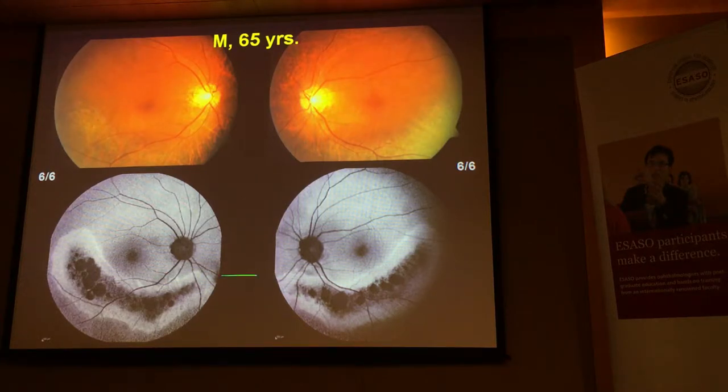So you look at this, and the clinical question that you have is: is it a photoreceptor dystrophy? And if so, is it restricted disease or is it generalized disease? Because so-called sector retinitis pigmentosa is a good disease to have if you have to have retinitis pigmentosa, because it's restricted disease. But you can get restricted pigmentary deposition in the context of generalized retinal disease. So you need the functional data to be able to determine what's happening.